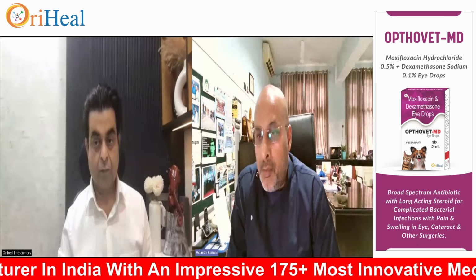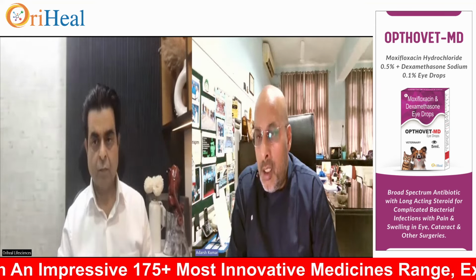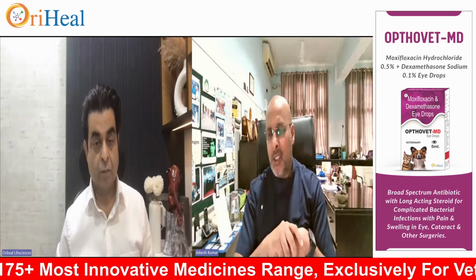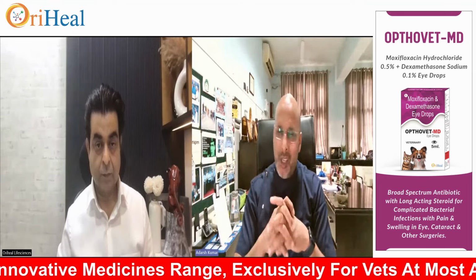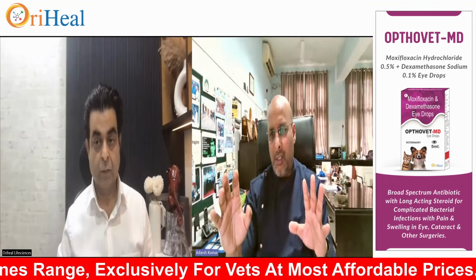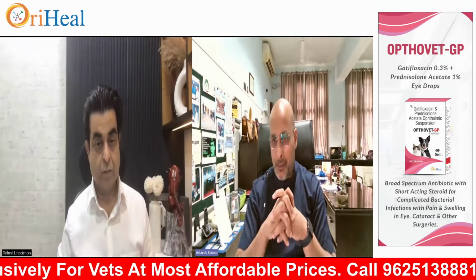So if an X-ray machine is available, dental surgery is possible. The X-ray machine is a must, I tell you now. Very small X-ray machines are available, the DR ones. So it is always better to have an X-ray machine if you are doing this. If you don't have one, you can still do it, it doesn't matter, but don't go for very complex extractions that should be technically sound if you are not using X-rays.